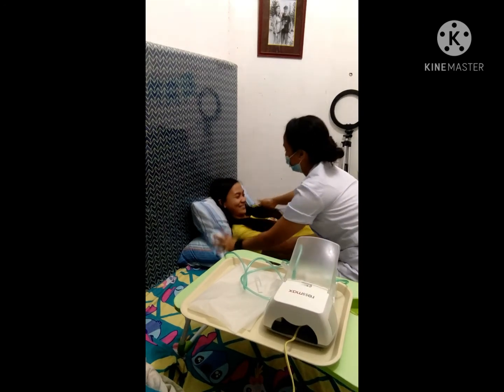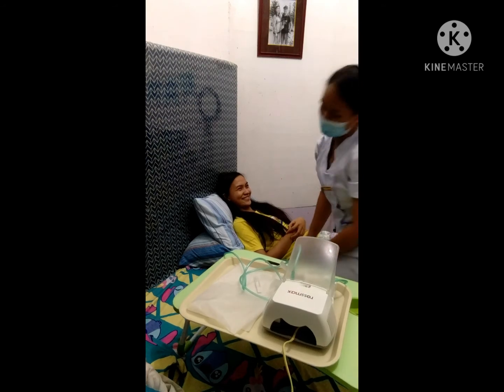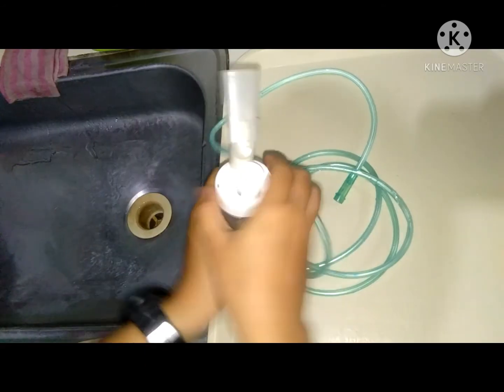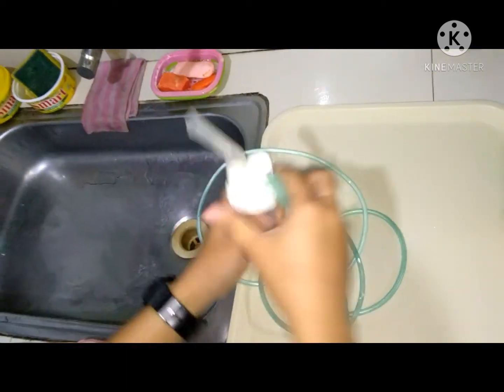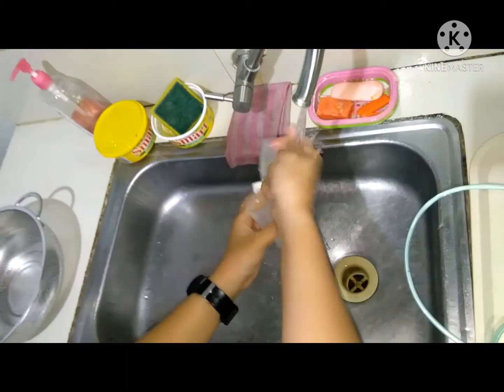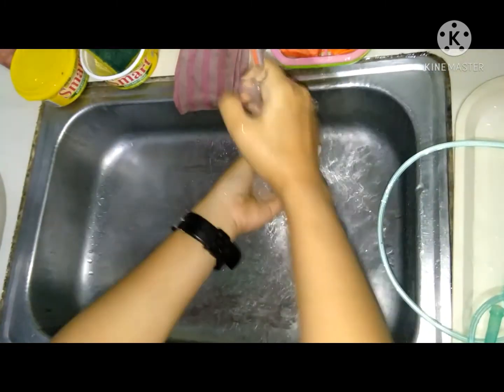Ensure that the patient is left feeling as comfortable as possible. Wash and dry the nebulizer, tubing and mask, or mouthpiece with warm soapy water.